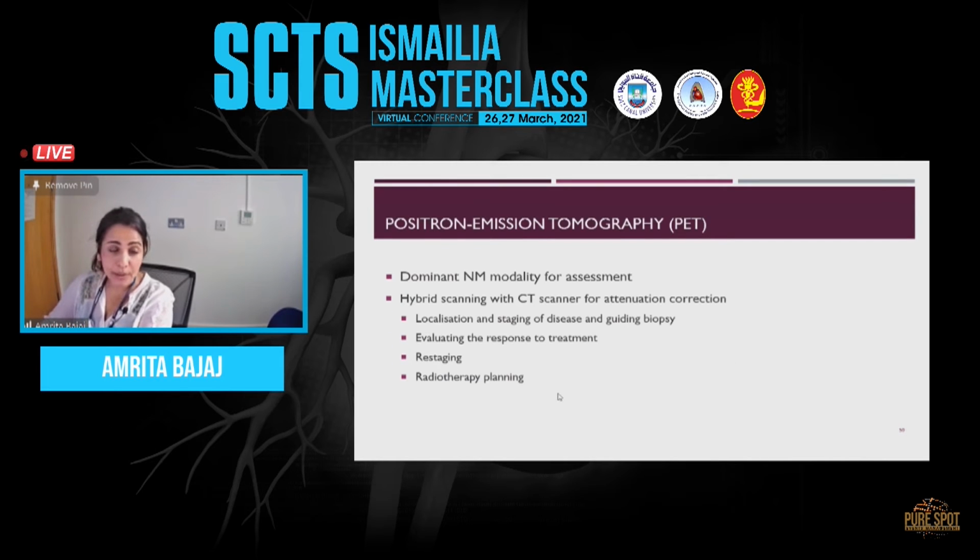This is something we use routinely almost always in all our oncology imaging, which is PET imaging. PET imaging is a functional imaging modality for particularly oncology, thoracic oncology. We use FDG PET, which is really taking a glucose analog and you attach it to a radioactive tracer, and you then inject it into the body, and anything which is metabolically active will take it up. Now, it's got its limitation that it'll take it up, but doesn't tell you anatomy. So if you do it along with CT, you synergistically take out the individual limitations of both the modalities.